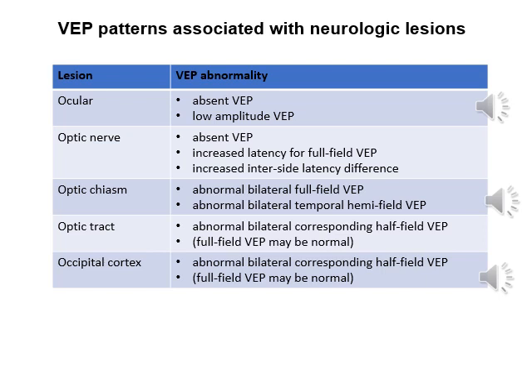If there were a lesion at the optic tract, the optic radiations, or at the occipital cortex, the binocular full fields may look normal, and the best way to test for a lesion in these areas would be to do a half-field, a hemifield recording. And so in this case, the corresponding half-field stimulation would show an abnormality that corresponds to the side of the optic tract, optic radiation, or occipital cortex lesion.